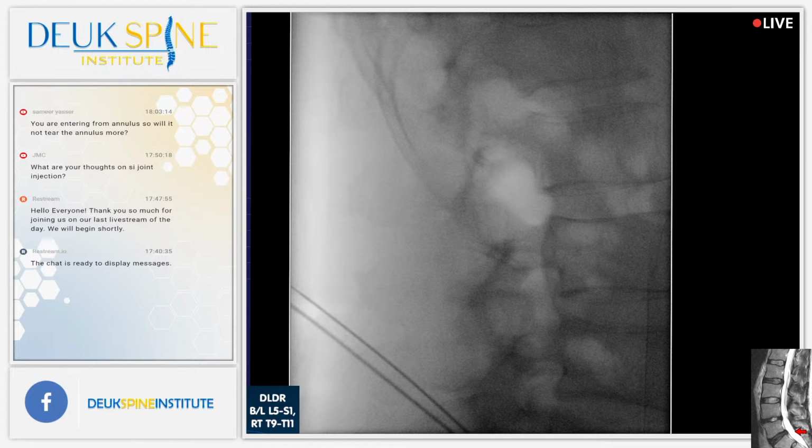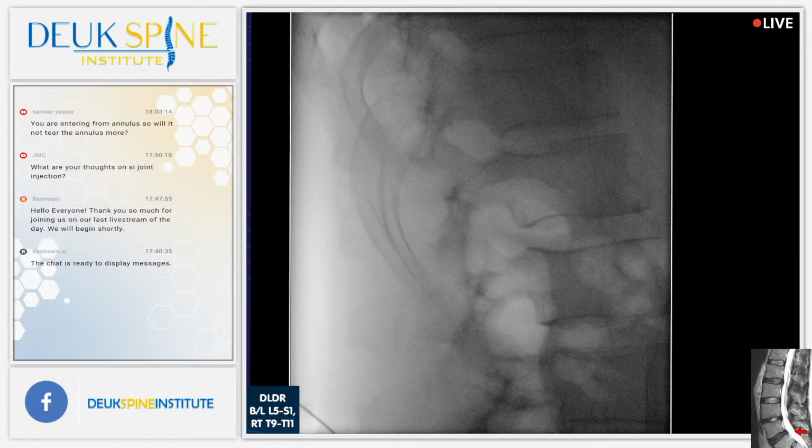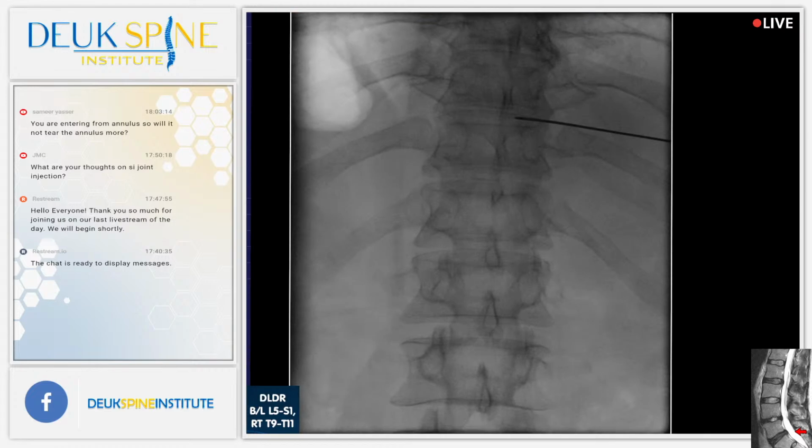Shot. Keep going north. I see 1. Shot. 12, 11. Keep going. Shot. Yeah. So for me, on the lateral views, we're at 10, 11. Let's go AP one more time. We're going to need him awake in about 5 minutes. Perfect. All right. Let's get the next one in.